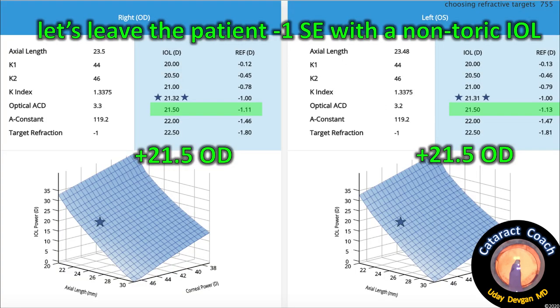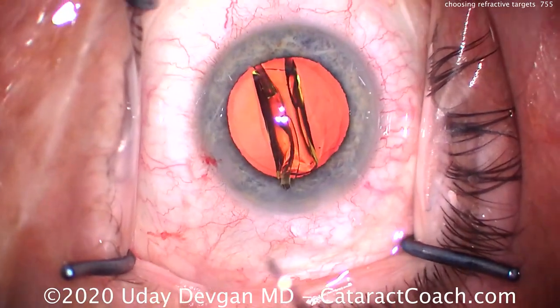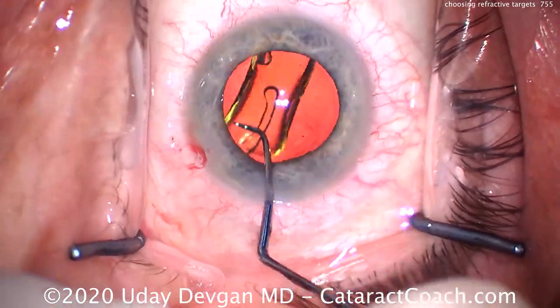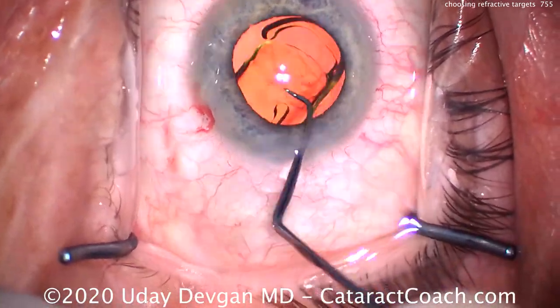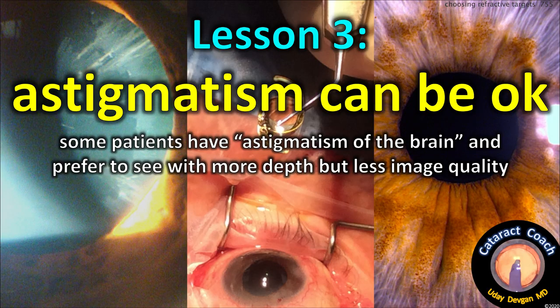Let's leave the patient with a minus one spherical equivalent and give him a non-toric lens — now he's going to be happy. We'll insert the non-toric lens with that minus one post-op goal. It's a very nice outcome for this patient. Lesson three: astigmatism can be okay. Some patients have what I call astigmatism of the brain — they prefer to see with more depth but less image quality. That's what they're used to.